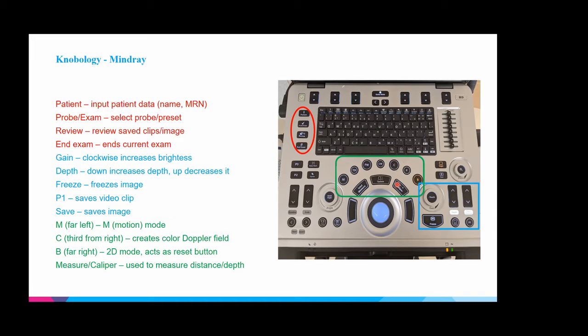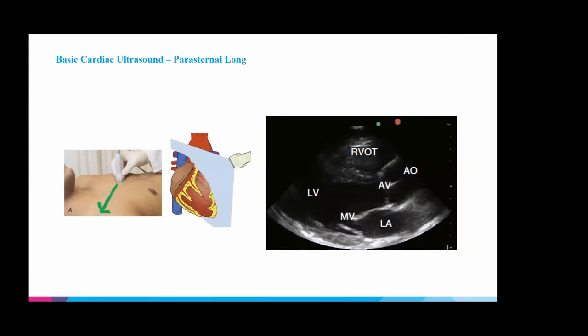So that's the basics of knobology, on what you can do on the ultrasound machines. I just wanted to run through this to catch everyone up to speed. Obviously this might be a review for many of you who've done the ultrasound elective or rounded in the ICU and tried out ultrasound on the patients. But I just want to run through all the basic point of care ultrasound views.